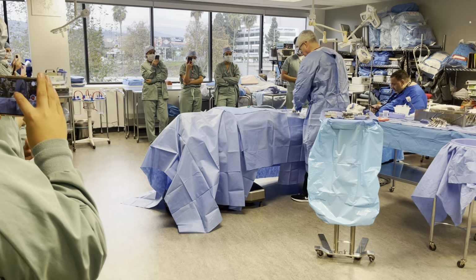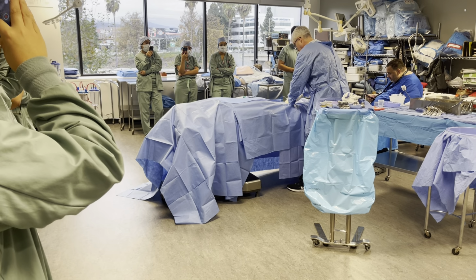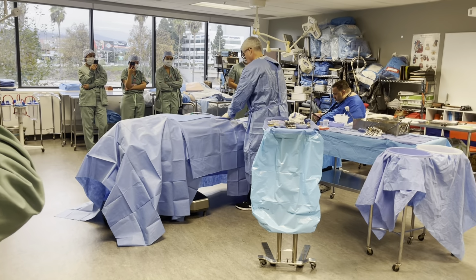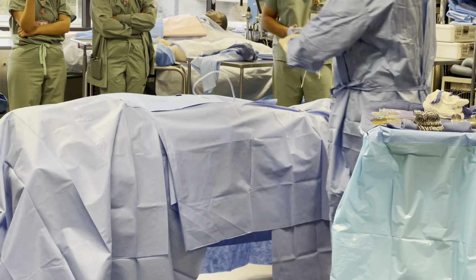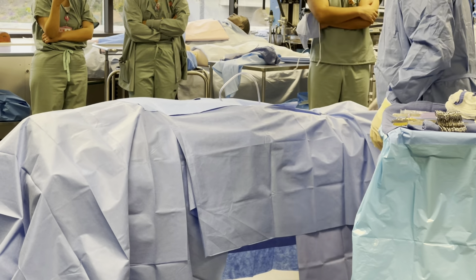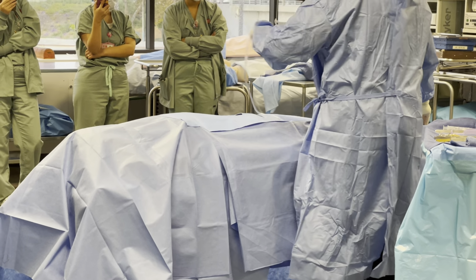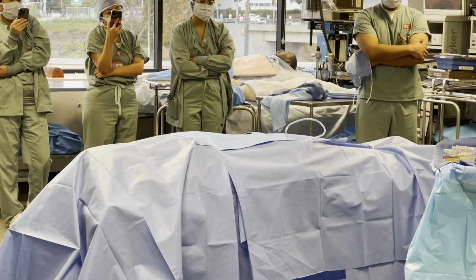Just so you can see what I'm doing, I'm taking a little bit of the drapes and making it so that they're managed, so that nothing's gonna happen. Whatever distance I have for myself, that's it, because from here I can't pull any of this stuff up anymore. So if you don't do this right the first time, you are out of luck.